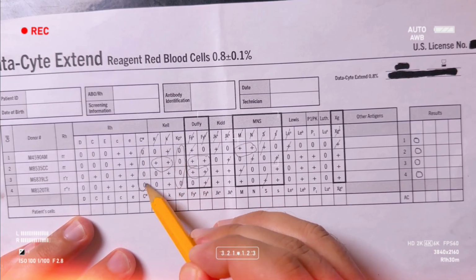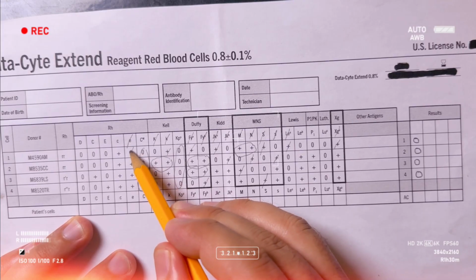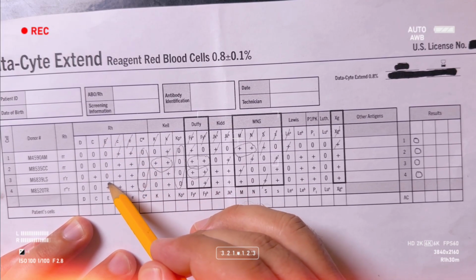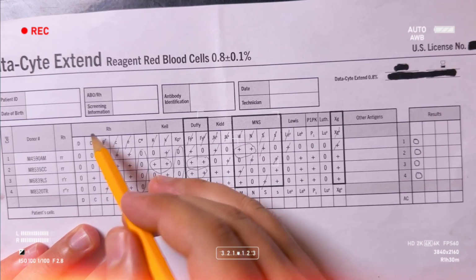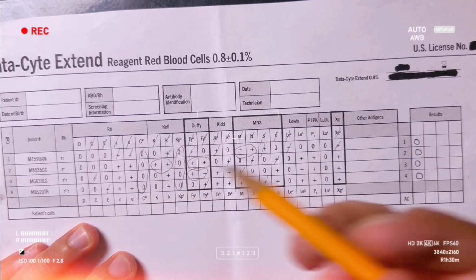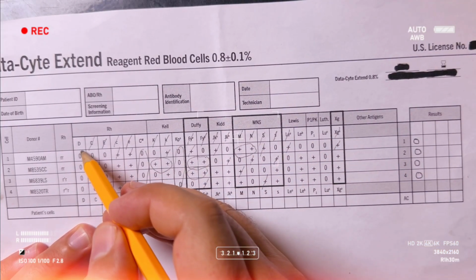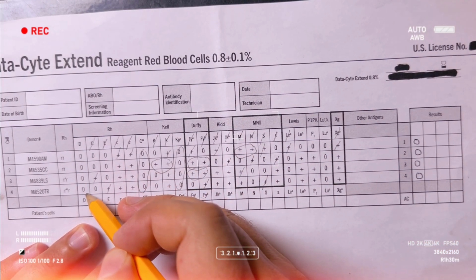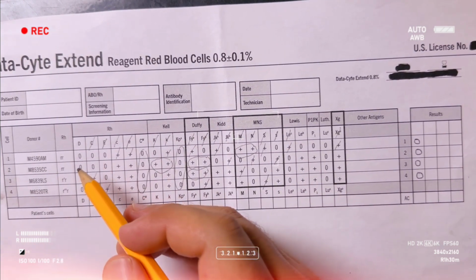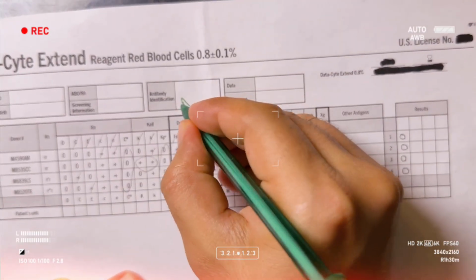It's not clinically significant, no reaction here. The little e, I'm able to rule out. Little c, I'm able to rule out. Big E, it can be ruled out. C can be ruled out. So everything is ruled out except D. There is no reaction here, even in all 4, 0 reaction. So our antibody is anti-D here. So it's anti-D.